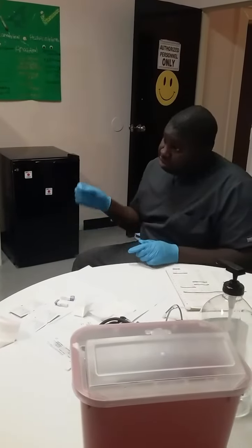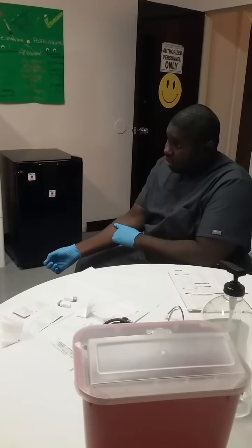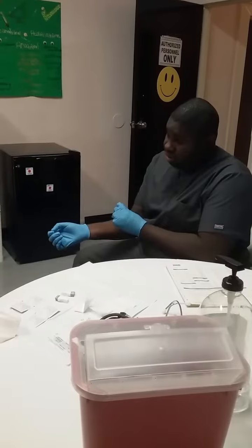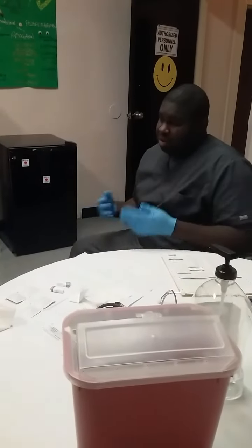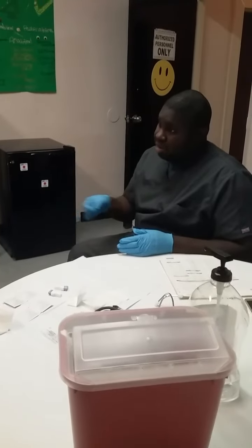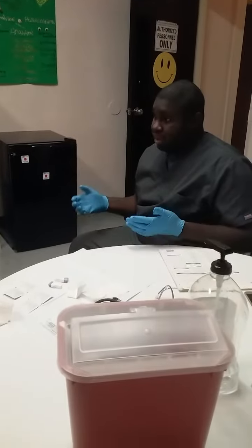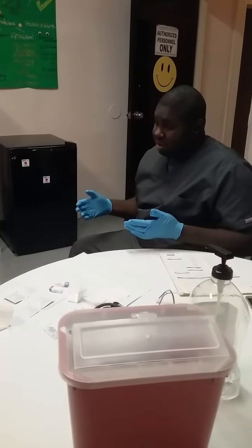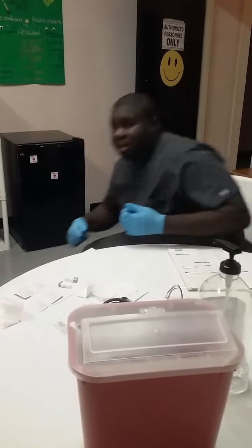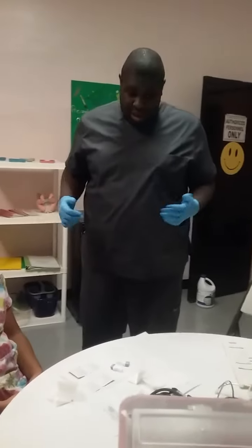We're going to make a small incision in this portion of your arm right here, and when I make the incision, I'm going to time it and see how long until your blood stops. Every 30 seconds, I'm going to be blotting your blood until it completely stops. That's what the bleeding time test is. Do you understand? Okay. So now we've explained everything, so now it's time to get to it.